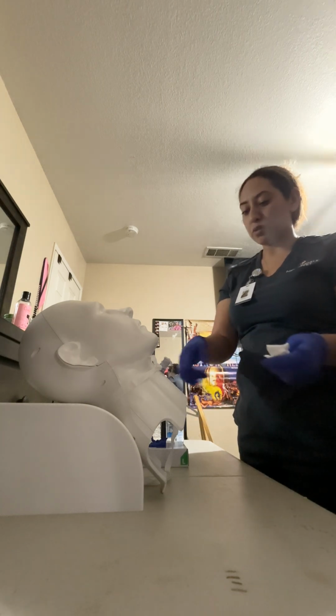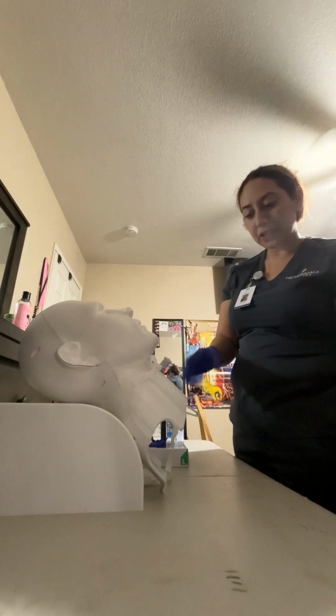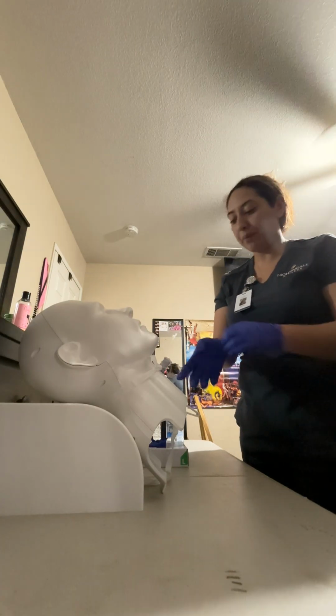Once removed, I will take a look at the surrounding tissue for any redness, swelling, any indications of infection. At this time, I don't see any of that. I'm going to go ahead and take these gloves off. I'm going to wash my hands again, and I'm going to prep the rest of my supplies.